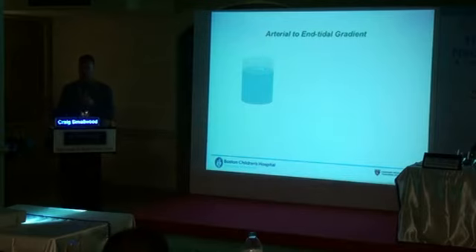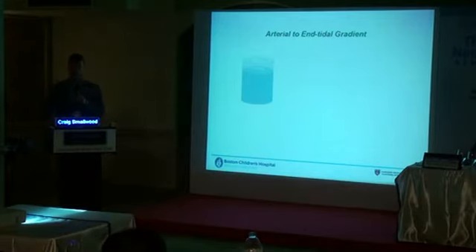CO2. So PaCO2, that is the partial pressure of CO2 in the arterial blood, is what we see in an ABG. And that is what we want to assess when we get end-tidal CO2 most of the time. So if we have an end-tidal CO2 value that's climbing, what we want to do is say, well, that's probably pretty close to the PaCO2, and we should increase ventilation to make sure that comes back down to a level where we would have a good pH and a good CO2 level.